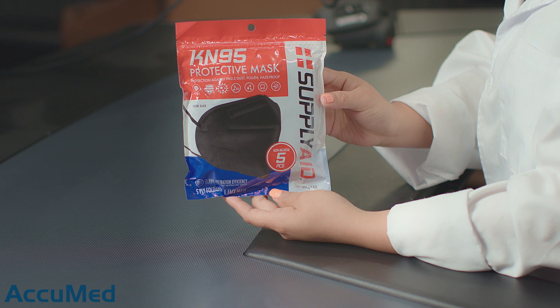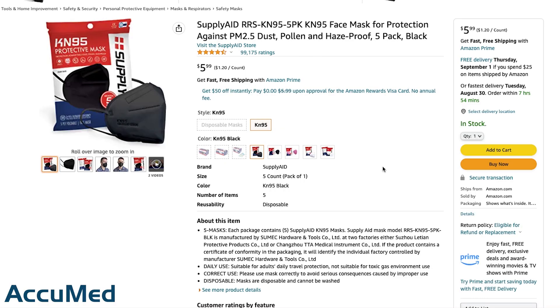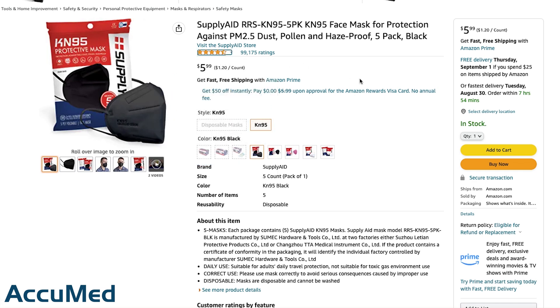Hello everyone and welcome back to the AccuMed channel. Today we're going to be reviewing the SupplyAid KN95 face mask. These masks are made in China and here is the Amazon listing. They're currently $5.99 for a 5-pack with a 4.4 out of 5 rating and over 90,000 reviews.